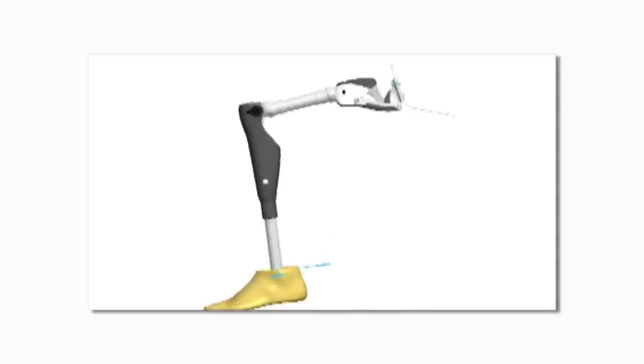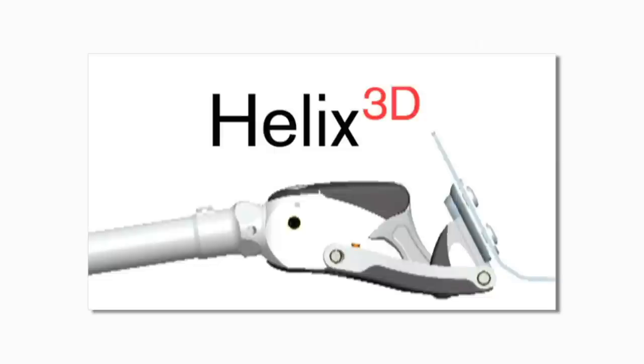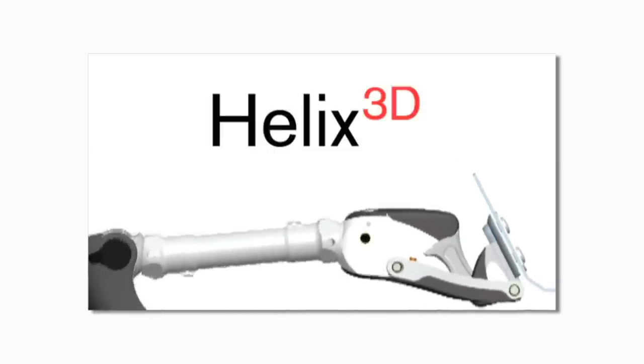There's a new solution for individuals with hemipelvectomy and hip disarticulation amputations: the Helix 3D hip joint from Ottobock Healthcare.